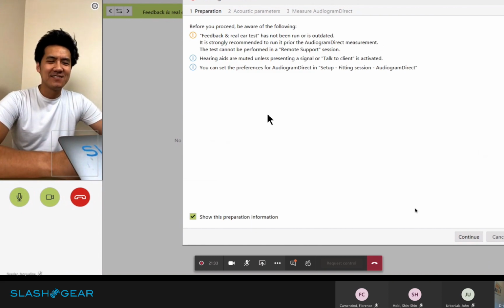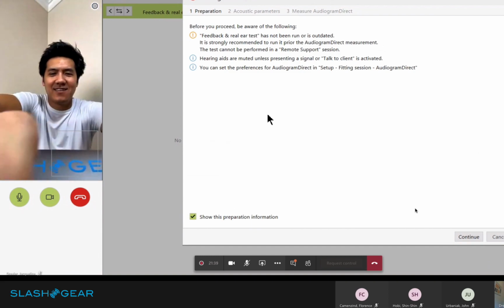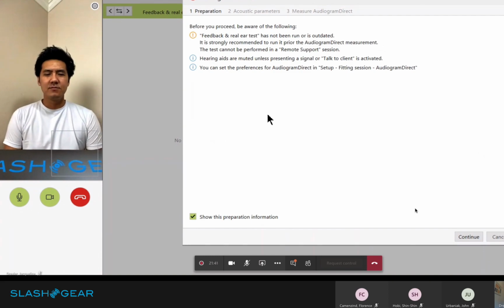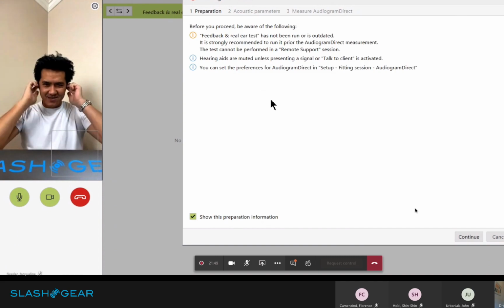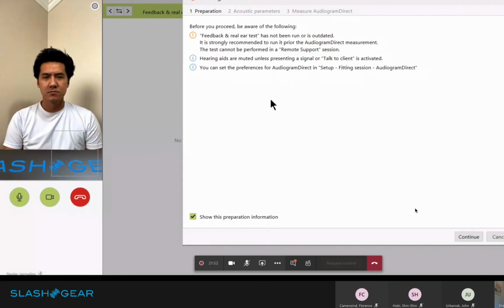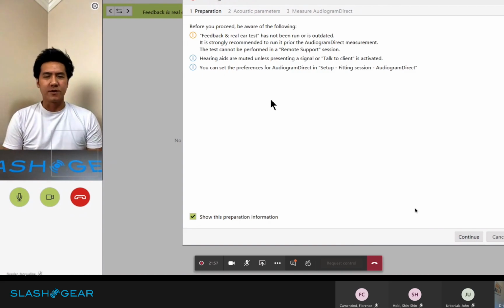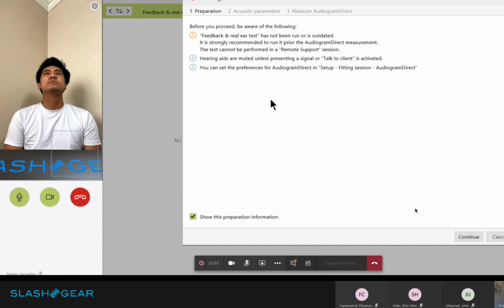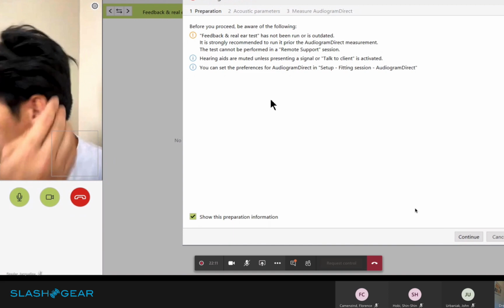The reason for that is because since I'm doing a hearing test, it would be good that you don't see where I'm presenting. So you can make sure the results are appropriate. Okay. All right, no cheating. And I assume your hearing aids are nice and inserted. Okay. And what I would typically do is I would ask for you to try to come to the phone so I could see the insertion myself, to make sure that they look like they're deeply inserted.